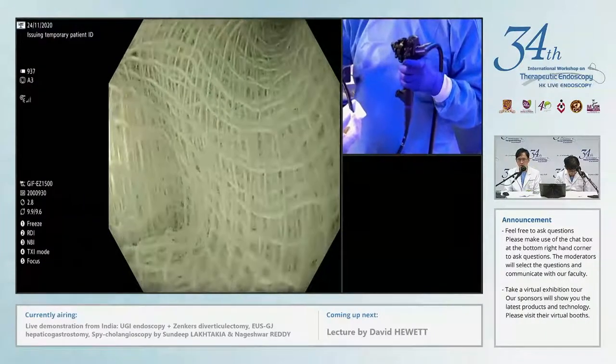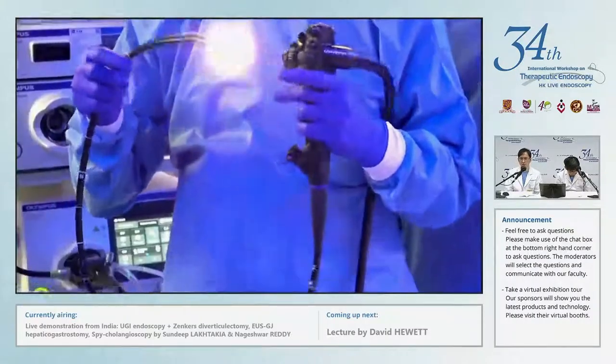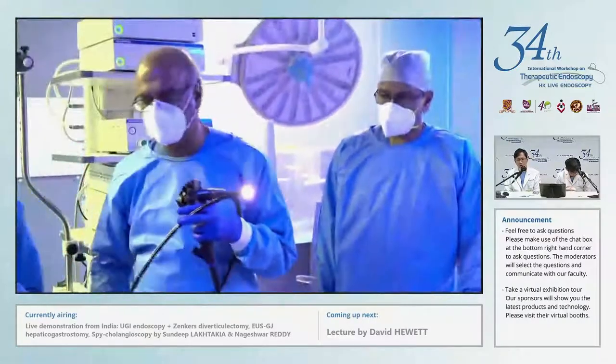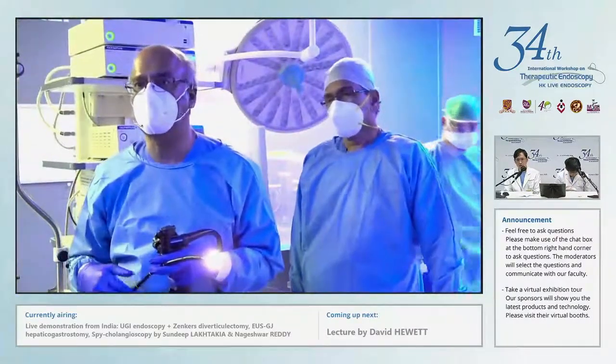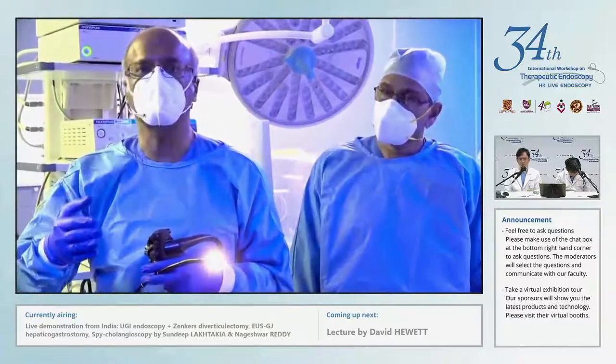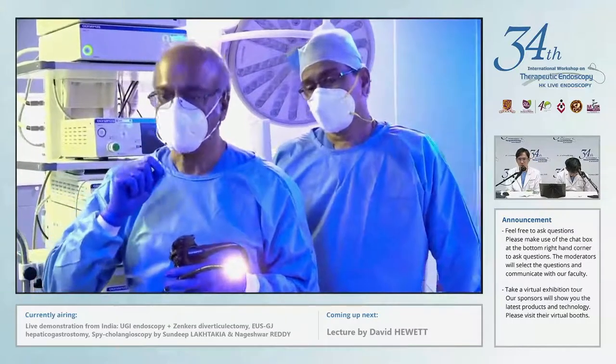These are the three additional facilities that you have with this, other than the standard scope. Of course, you have the NBI and white light. So I'm going to use this for this patient, and if there's any bleed, we can use the RDI. The patient is in left lateral, and what I'd like you to see, the camera may not show this very well, but we already have a special tube in the patient.